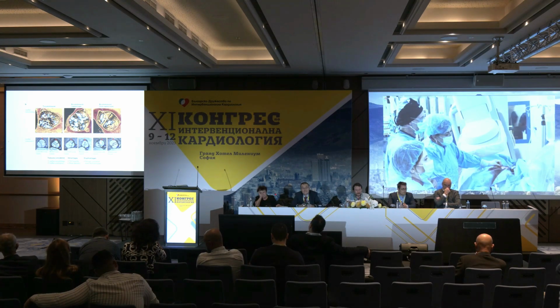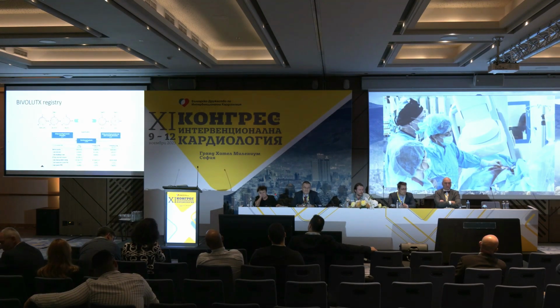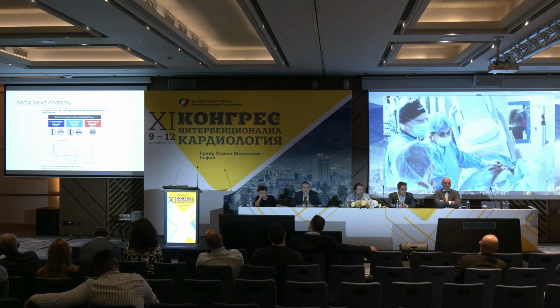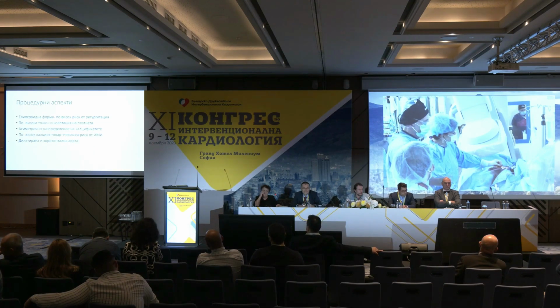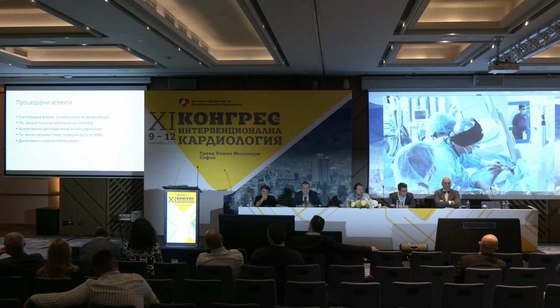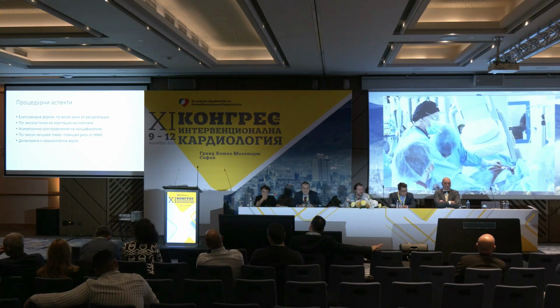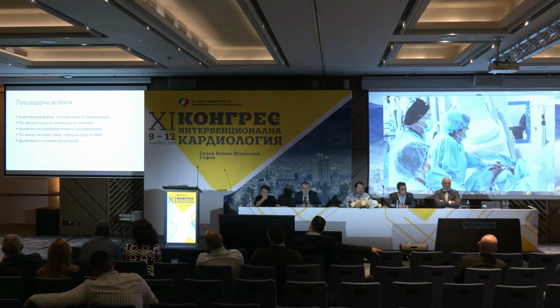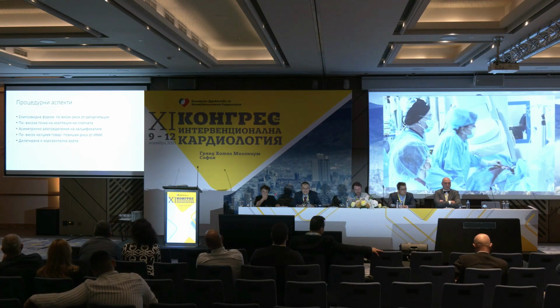Also, we have to appreciate the severity of the calcinosis, because patients with severe calcinosis on the raphe are the patients with the highest death rate in the long term when they're followed up. So the most problematic things here are going to be the ellipsoid form, the highest point of coaptation of the leaflets, asymmetric calcification, the higher calcium load, and dilated horizontal aorta.